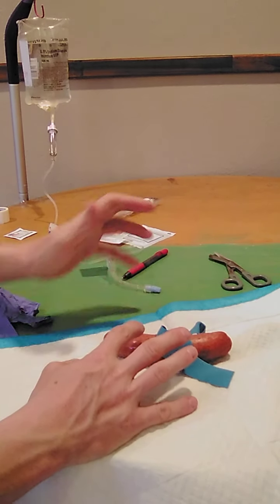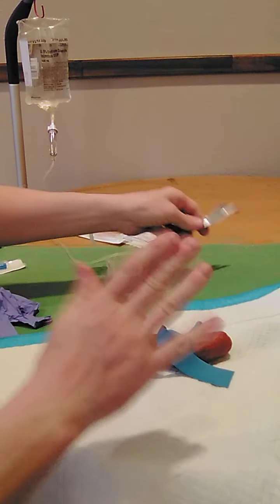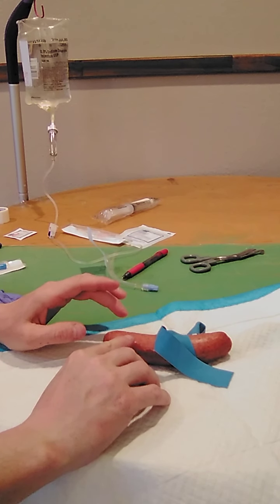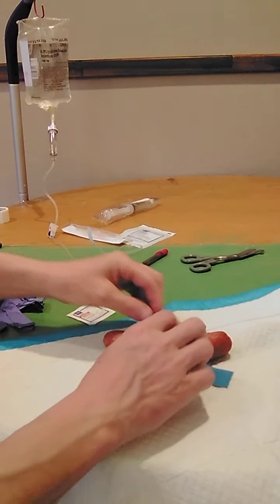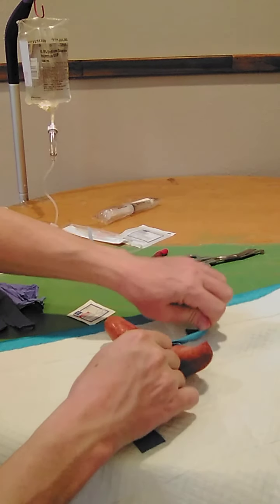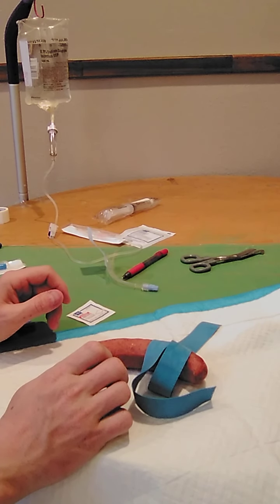So if there is excess hair present, with scissors I will clear that hair carefully, not shaving, so I can have a good clean approach to that place. So now I can remove this tourniquet, let the patient relax for a moment, and let the blood circulation do its purpose.